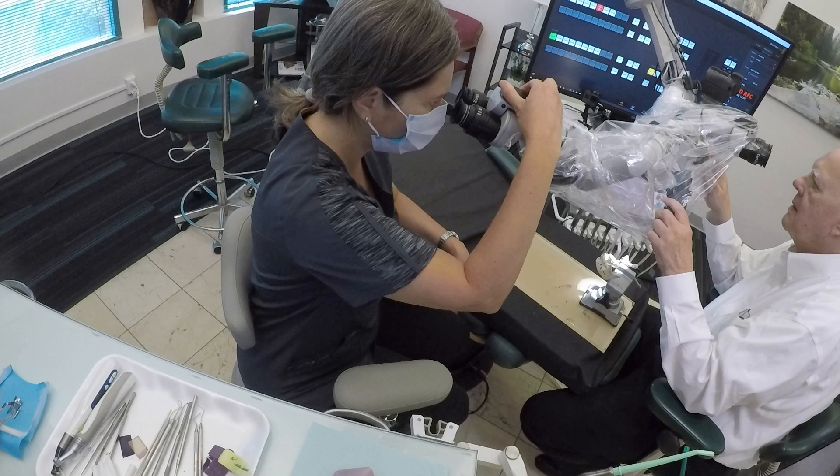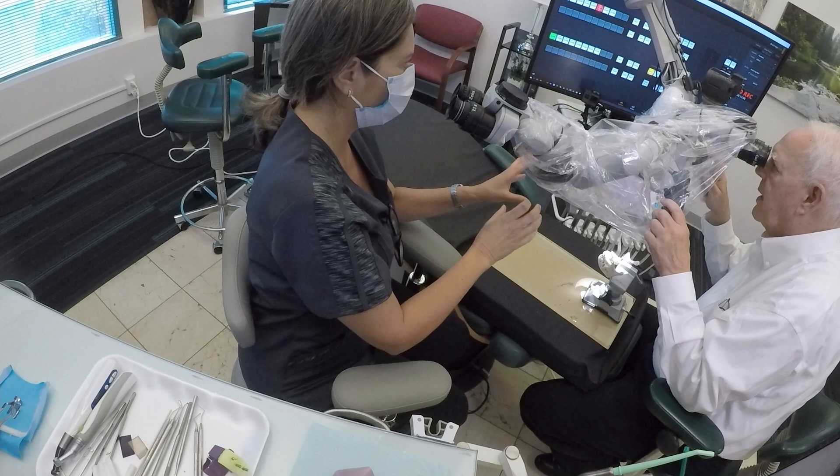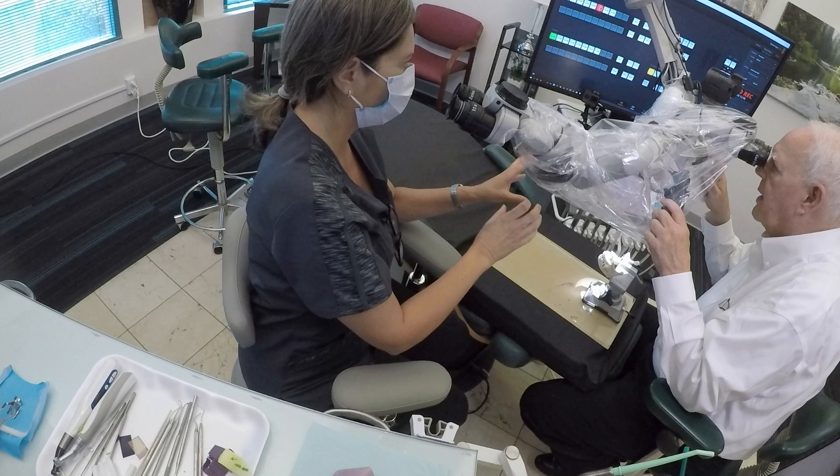I'm not seeing the tooth — can you just move it? There we go. Because I don't have any option to move. That's correct. This is cool — I see it. Can you see it as one image?